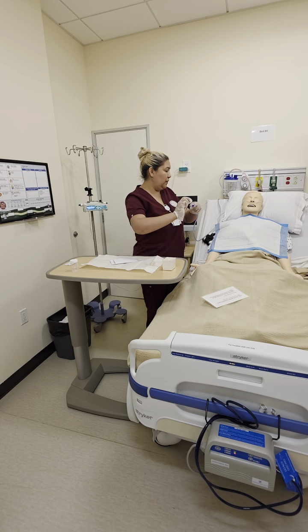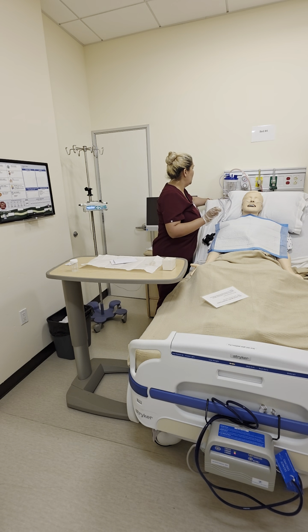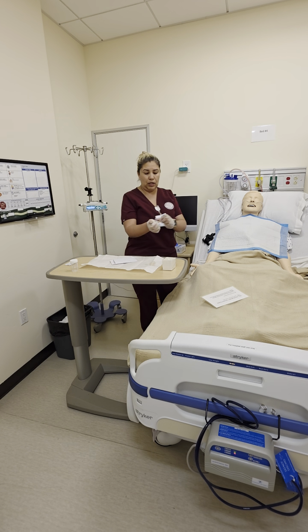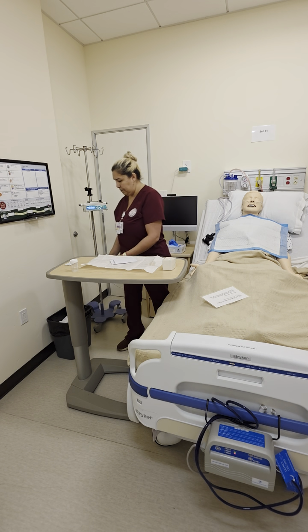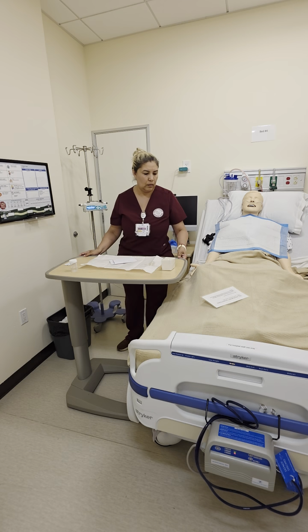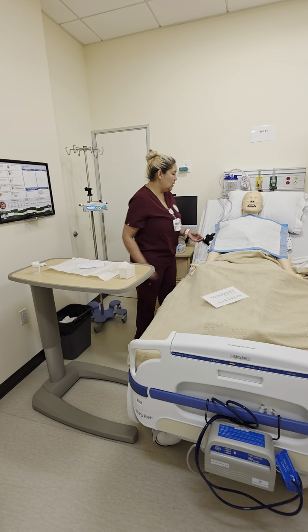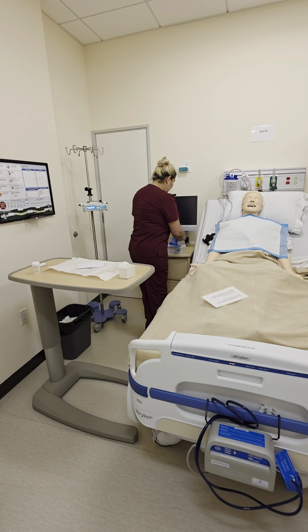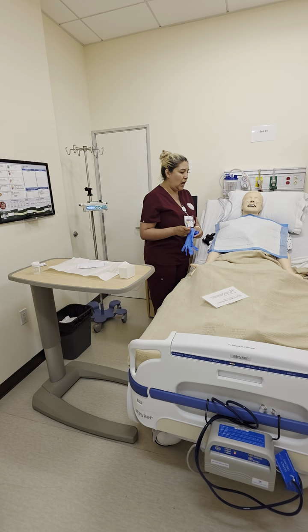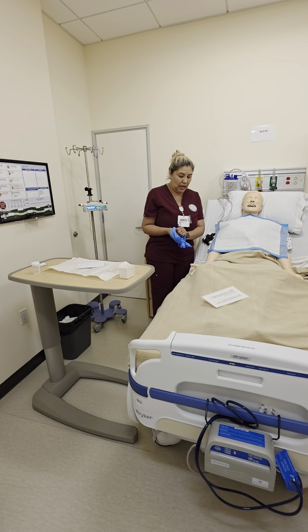I'm going to take this off. Turn off my canister. Get rid of this. Throw it in the trash. And I want to perform hand hygiene. Put on gloves. And what I want to do again is listen to my patient's chest. So I auscultate his lungs.